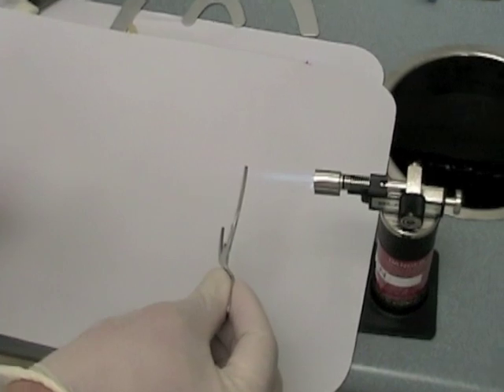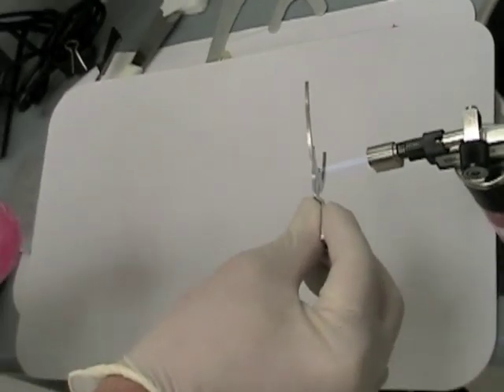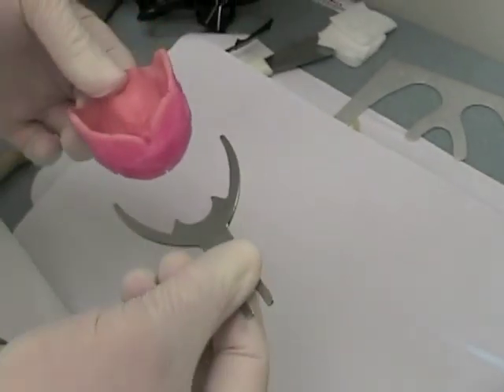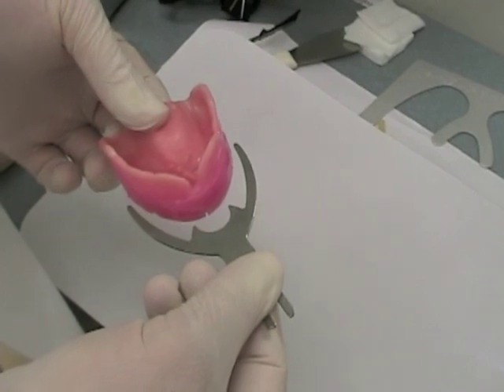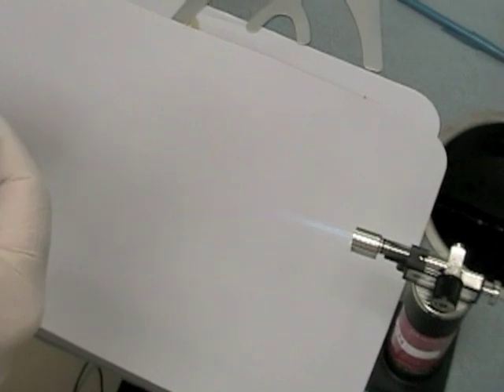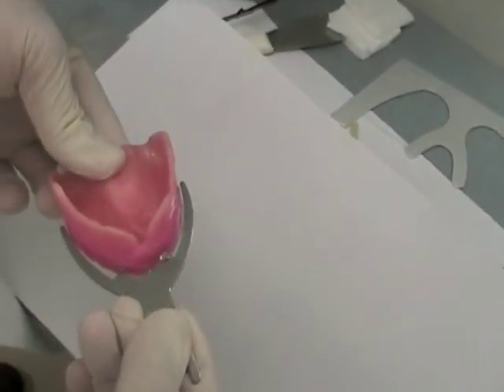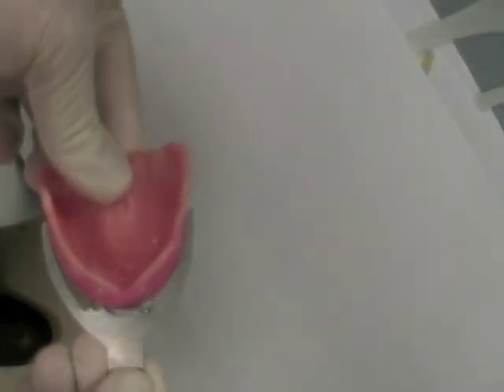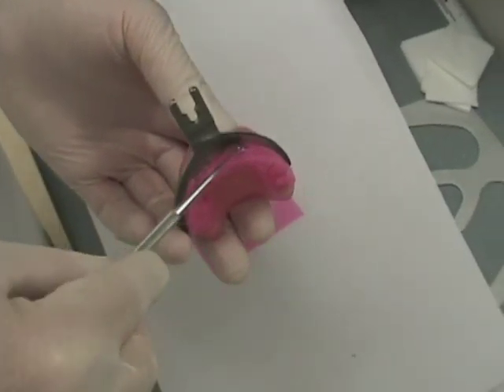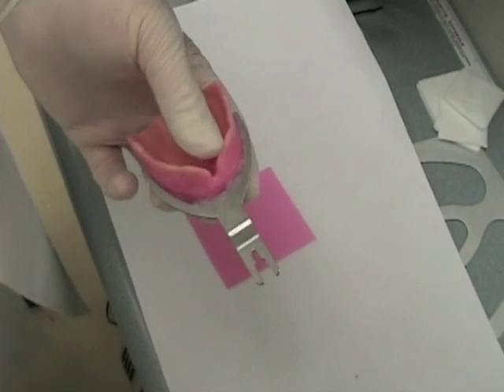Next, remove the bite fork from the face bow and heat up the tines of the bite fork with your Hanno torch, a butane torch, or a Bunsen burner. Then insert the heated bite fork into the wax rim, making sure to insert it so that it's parallel with the occlusal rim. Then heat up your number 7 wax spatula and melt the wax around the tines on the bite fork so that it's sealed to the wax rim.